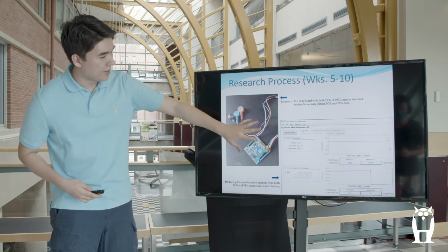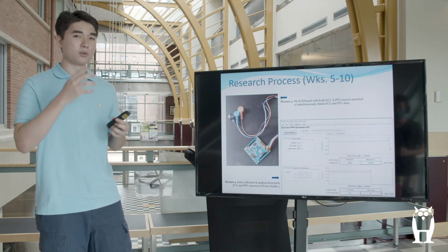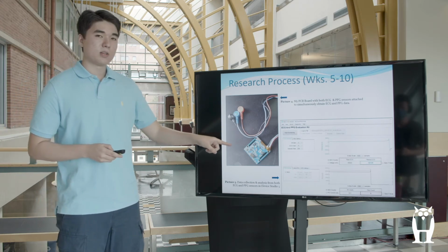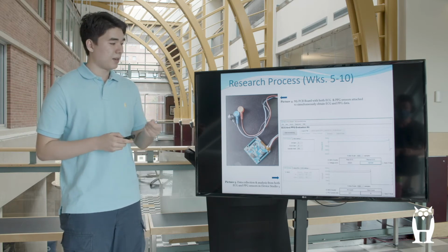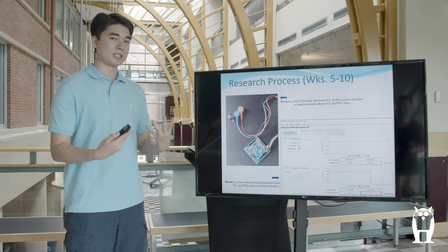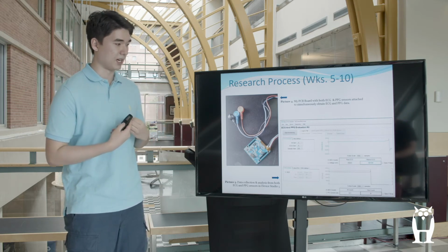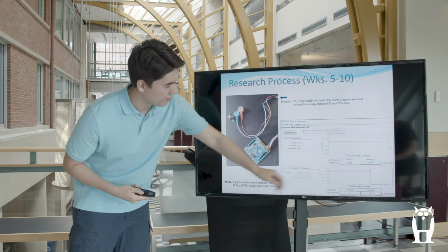And here is the program, Device Studio 5, which I used primarily to calculate my ECG and PPG data. How this works is, on the evaluation board itself, there's a PPG sensor. Once the PPG sensor touches your skin, it'll start collecting PPG data, while the ECG electrodes simultaneously obtain data at the same time, which will be graphed here in ECG and here in PPG.